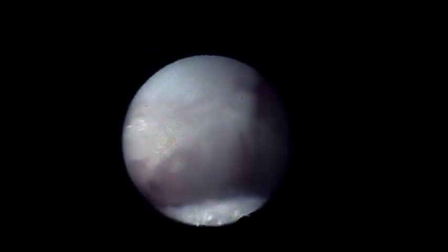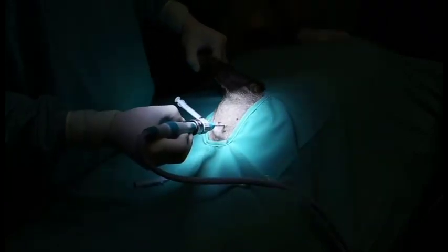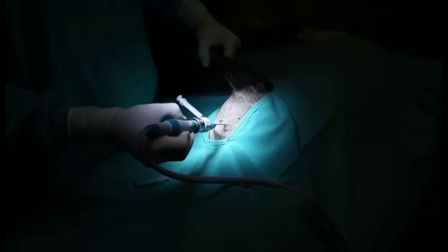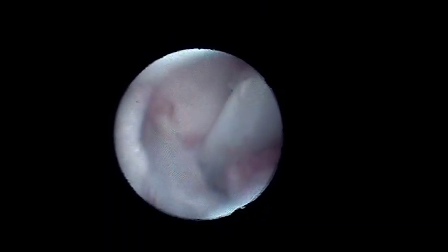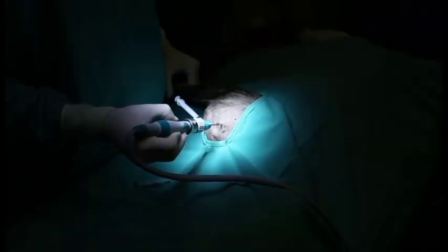The needle view rigid scope with directional view is 50% smaller than standard arthroscopes, incorporating both a high resolution lightweight 480-line digital camera and digital LCD medical grade monitor, and a xenon light source for superior illumination and color visualization. The system includes a full video and still imaging capturing system.